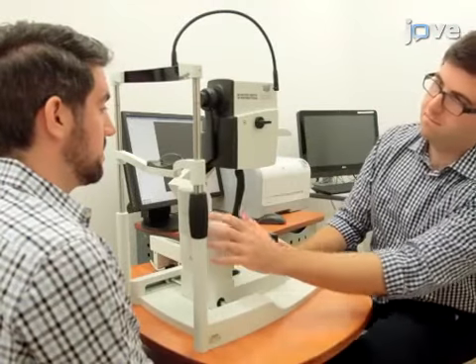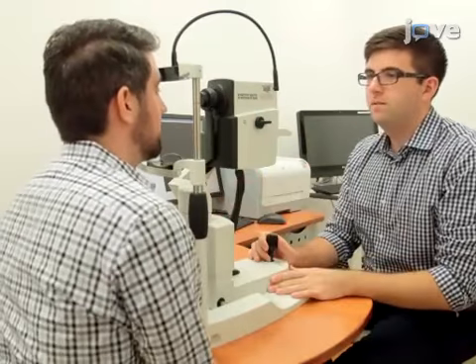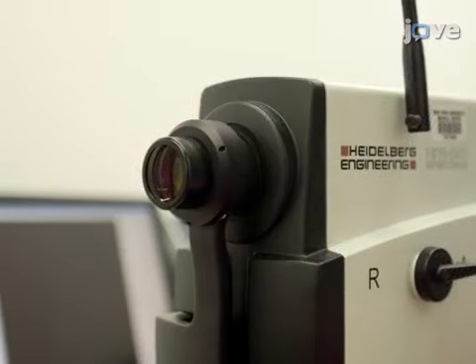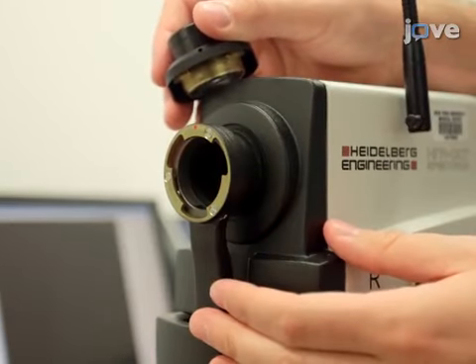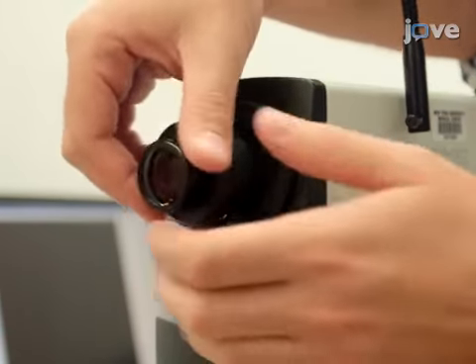Prior to imaging, appropriately set up confocal scanning laser ophthalmoscopy, or CSLO, for data acquisition according to the manufacturer's instructions. To mount an internal fluorescent reference, which is purchased from the manufacturer, twist the lens to remove it, unscrew the machine's metal ring, and replace it with the new metal ring containing the reference.